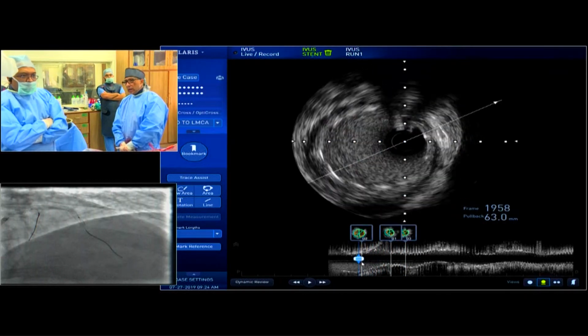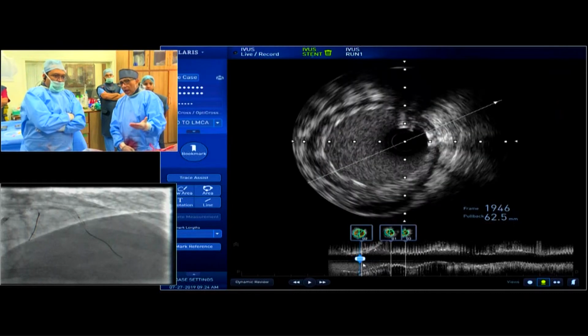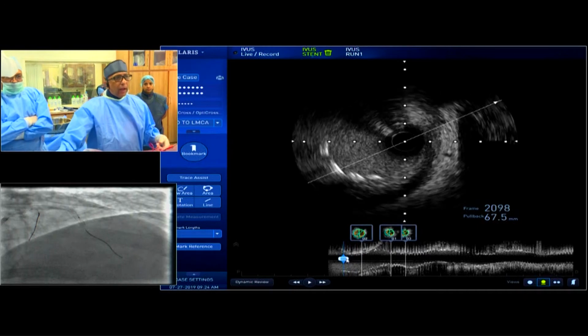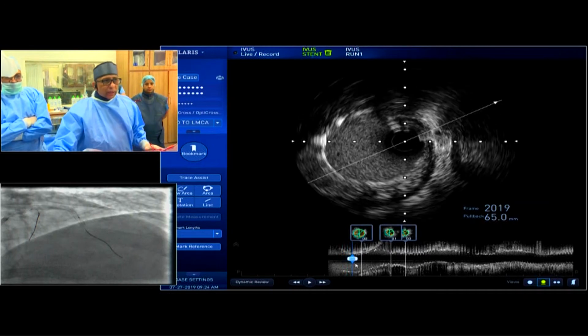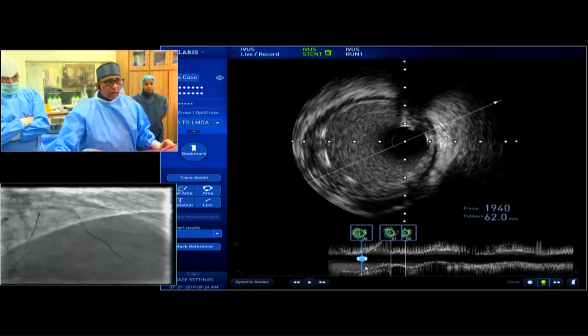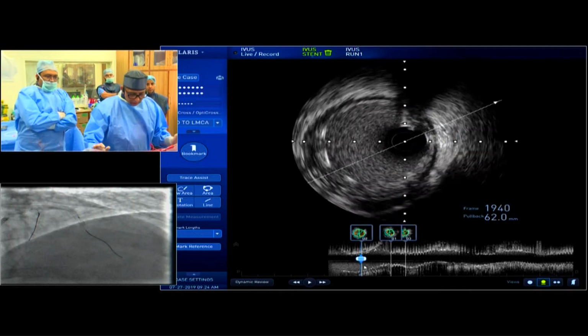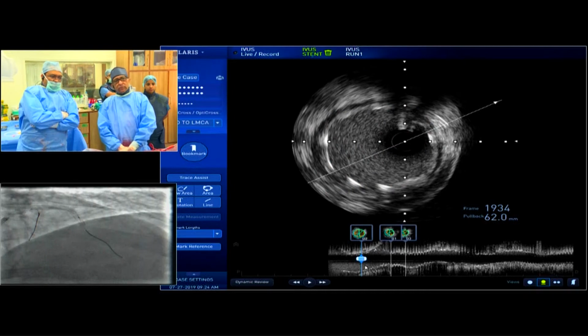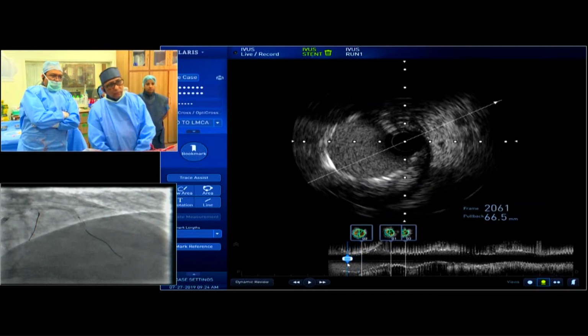I have never seen that. I have a series of more than 200 left main cases, and all are angioed after 1 year. It's less than 3%. It's a wonderful result, and actually we have some doubts regarding these things. One more comment from the audience.